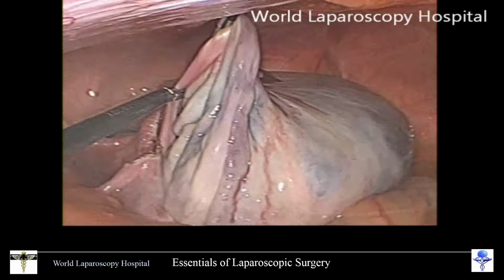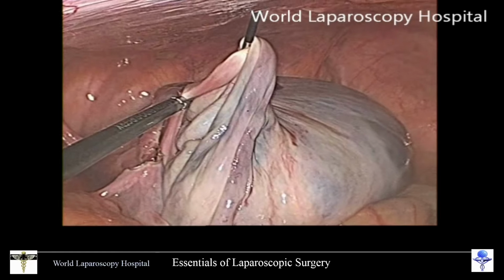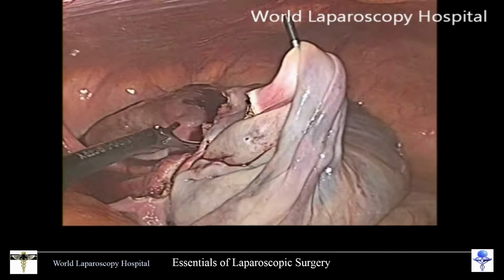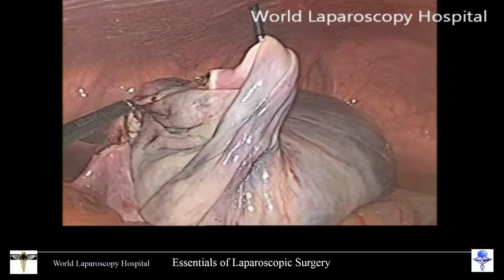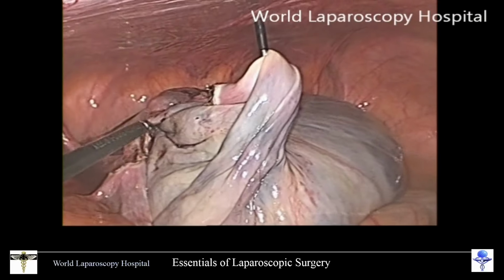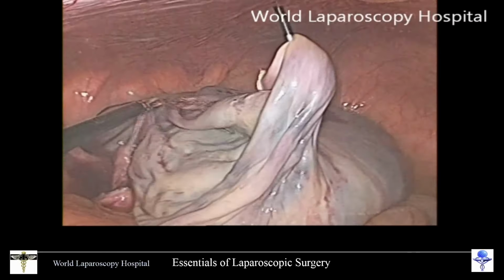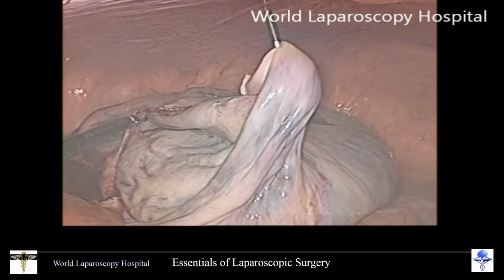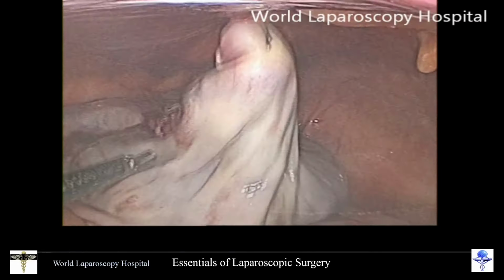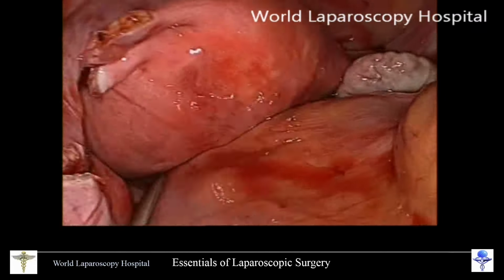This is easy surgery. Oophorectomy is much easier than ovarian cystectomy. Harmonic, as you know, can seal up to 5 millimeter of vessel. So, you do not need any suturing or knotting. Although, if you want, you can apply an extracorporeal knot for continuous structure, and then you can cut it medial to that or distal to that, and here it is done. Oophorectomy is complete. Now, that much big ovary, how to remove?